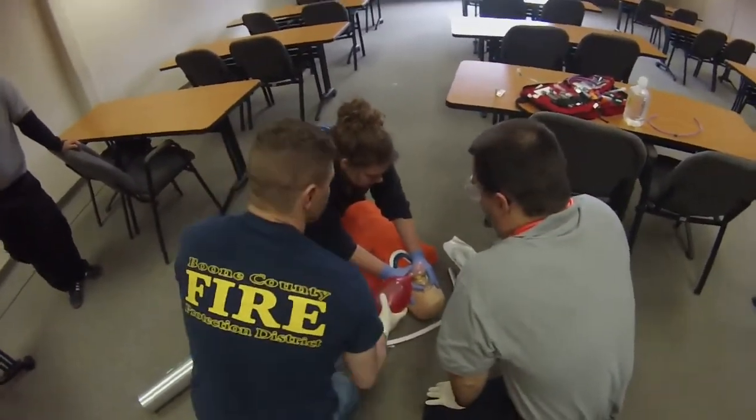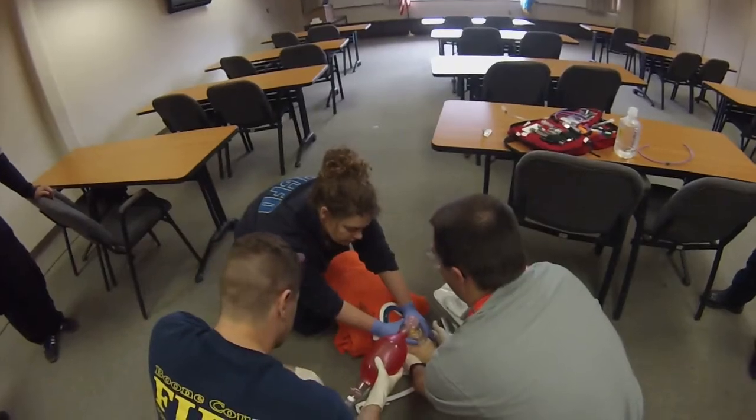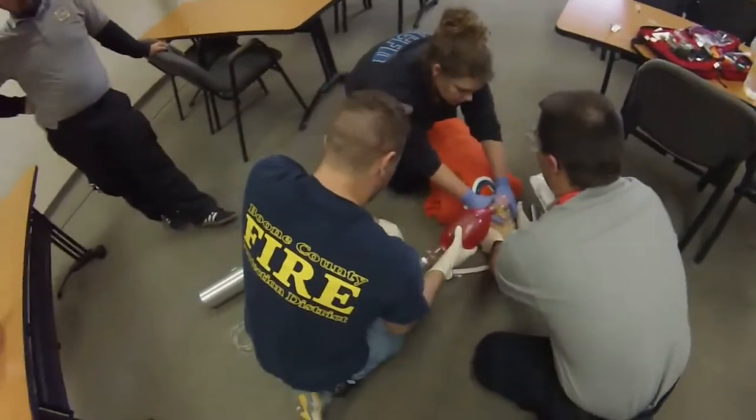When we get ready, what I'm going to have you do: you're going to pull the bag and the mask. You are going to take c-spine. You're going to pop that collar loose. I'm going to take c-spine for a second. You are going to move the collar, pull the oral airway, and then retake c-spine. From the front.